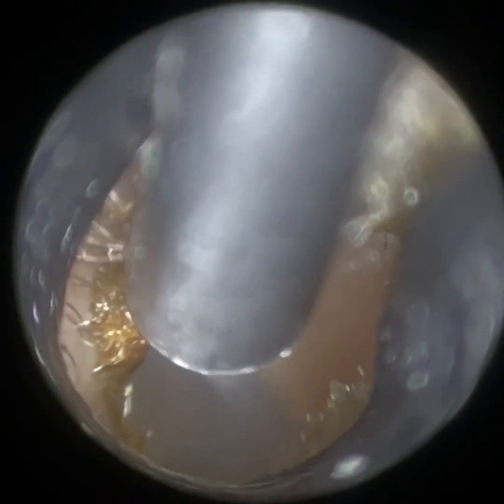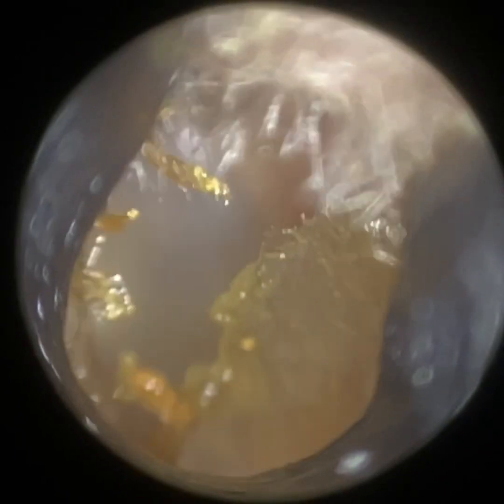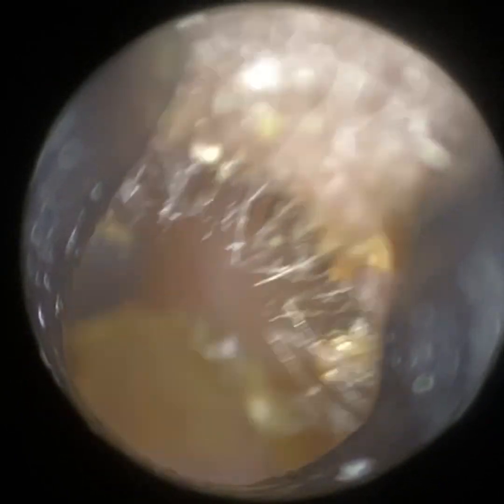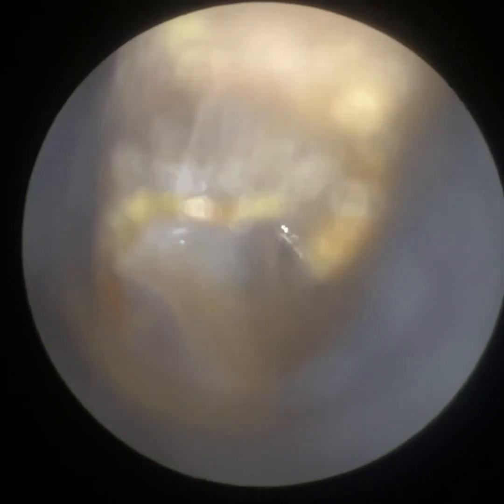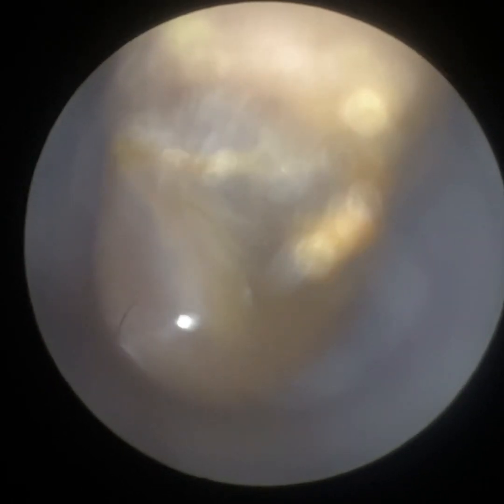There we are. You can see there's a bit of skin at the bottom — I just left that because that would have clarineted. Clarinetting is when you suction skin; quite often it can violently flap. With experience, I know it's going to violently flap. It's non-occluding. The clarinetting elicits a very loud, high-frequency squeal, which is definitely unpleasant not only for the patient but for myself.